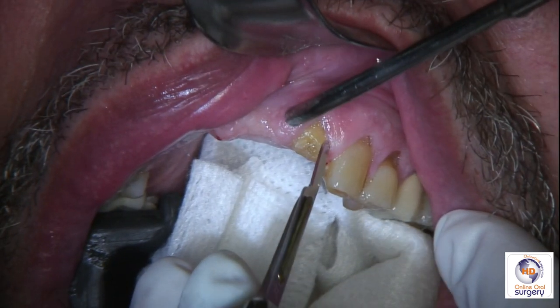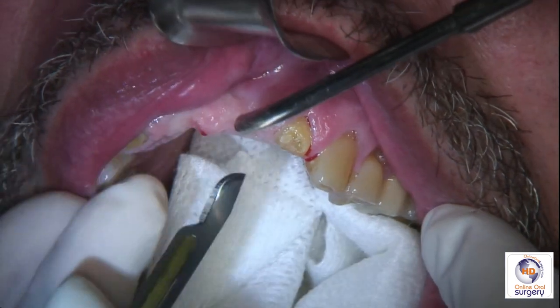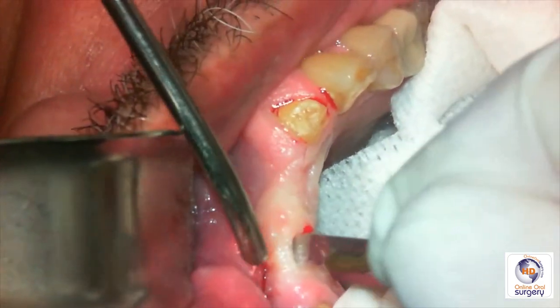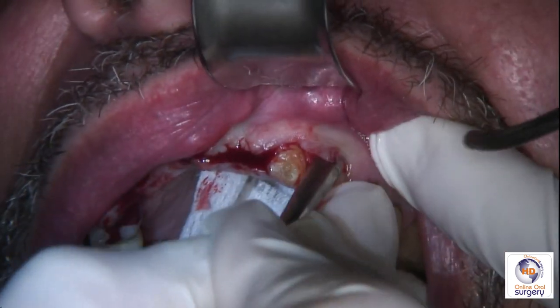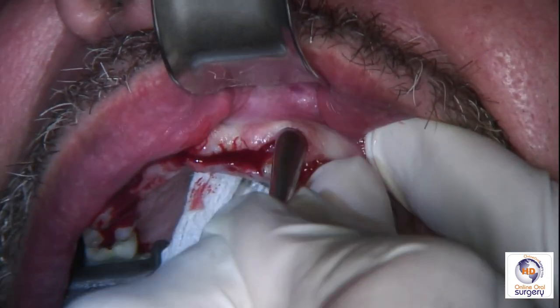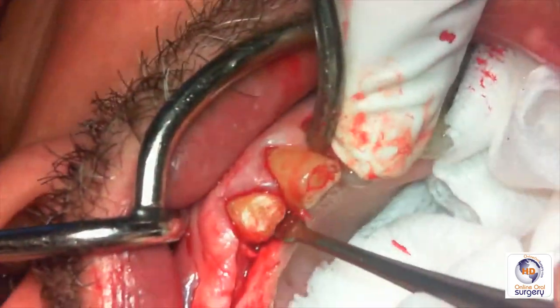We begin by making a sulcular incision just lateral to teeth number 7 and 10 in the interdental papilla, carry that across the alveolar ridge in midline of the crest, and lay a full thickness mucoperiosteal flap beginning between teeth number 6 and 7 and carrying that over between teeth numbers 10 and 11.